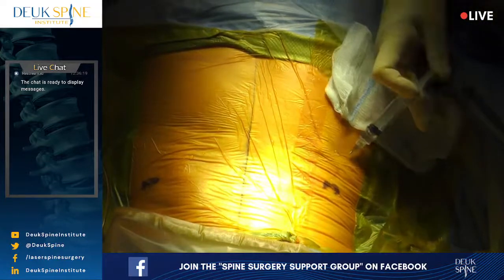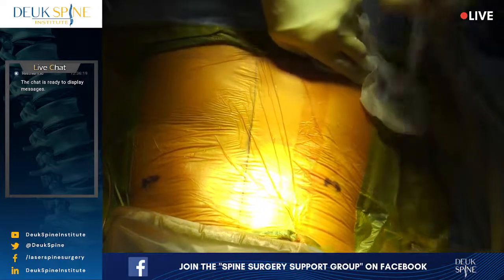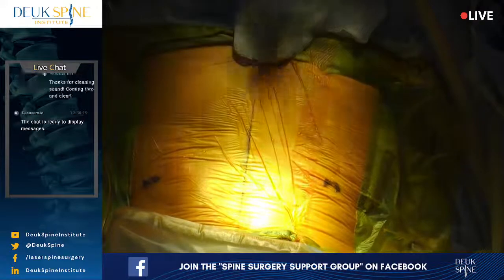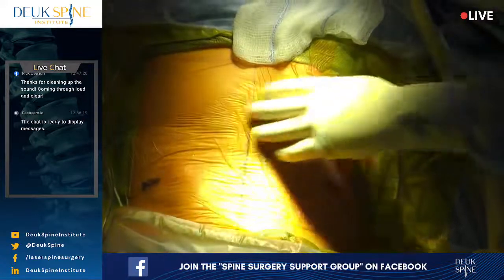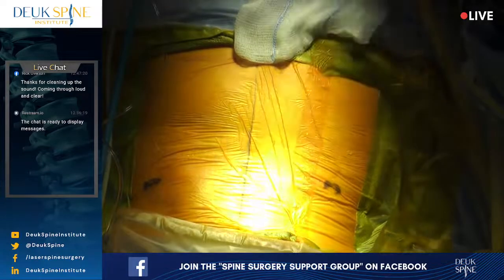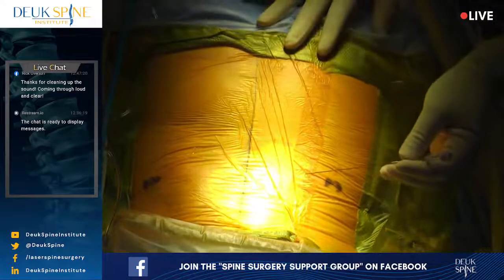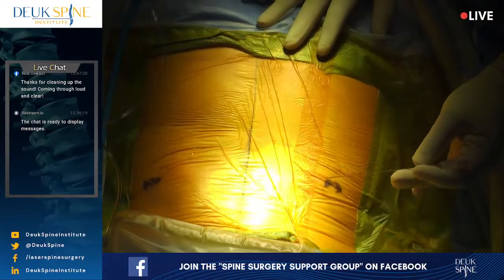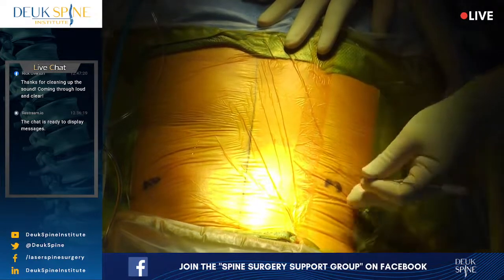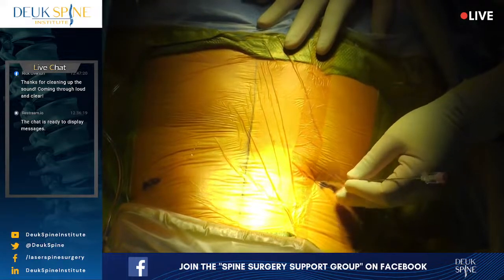And then we'll need a second on the left side, which this is the left side. 9 cc's. All right, watch the needle. So what I've done is I'm giving her some skin numbing medicine to make it more comfortable for her to do the surgery. And she's awake, so she will be awake for the beginning, and then we'll put her to sleep once we're ready to do the actual fixing the disc part. But to start things off, we need to get safely from here in the operating room down to the herniated disc, and that's what I am going to try to do right now.